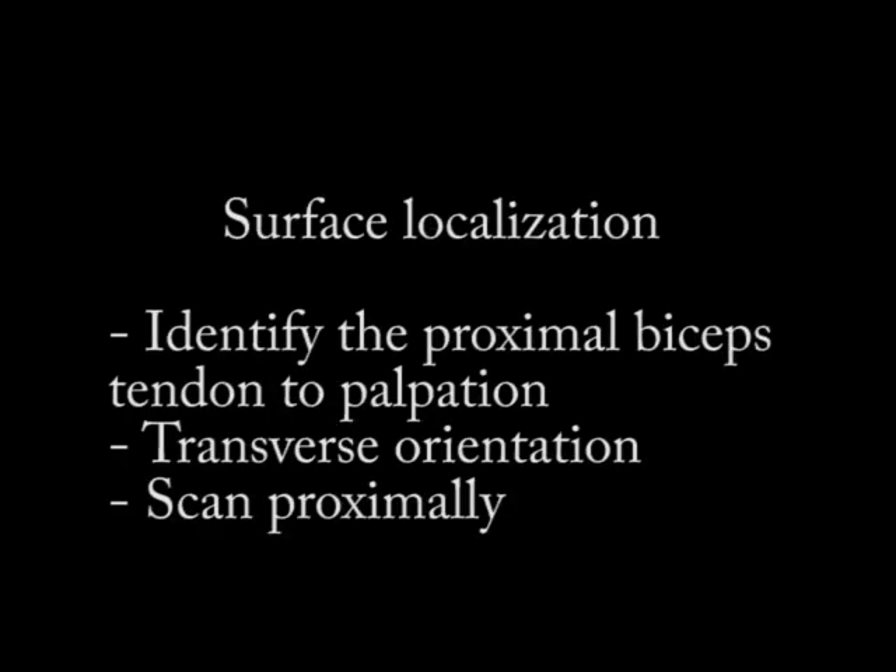With surface localization, I will identify the long head of the biceps tendon proximally to palpation. Once I've identified it, I'll put the ultrasound probe in transverse orientation over the tendon and then I will scan proximally to find the rotator interval.